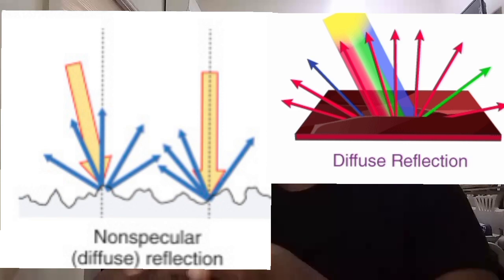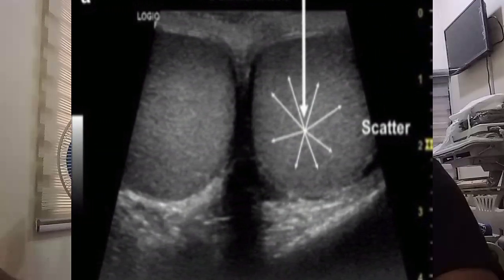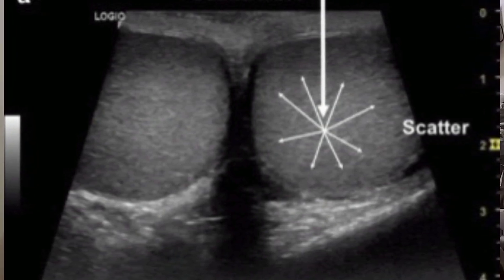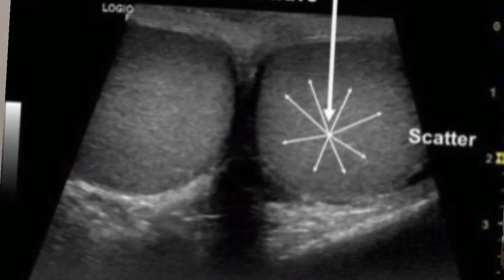Backscattering occurs in heterogeneous materials such as the parenchyma of soft tissue, liver cells, kidney cells, pancreatic cells, or the myocardium of the heart. It will also occur in pathological masses, and in fluid collections that contain significant particulate matter. The amplitude of backscatter is relatively angle independent but very frequency dependent. That is to say, as transducer frequency is increased, so does the size of the backscattered echo.